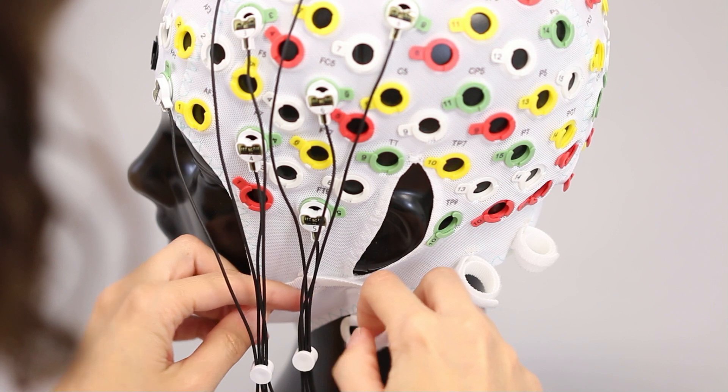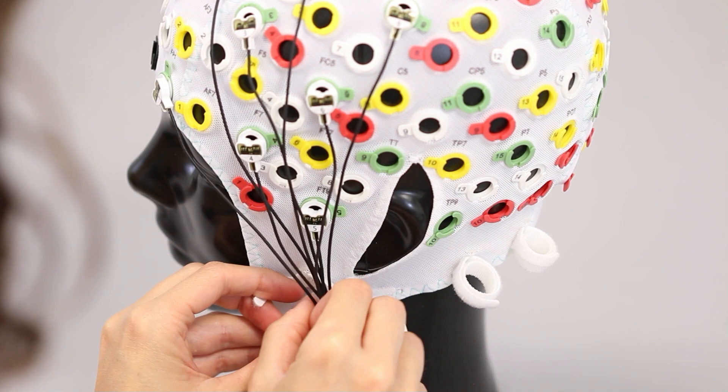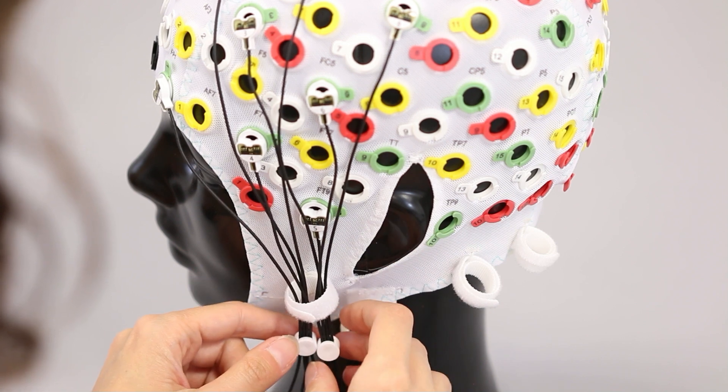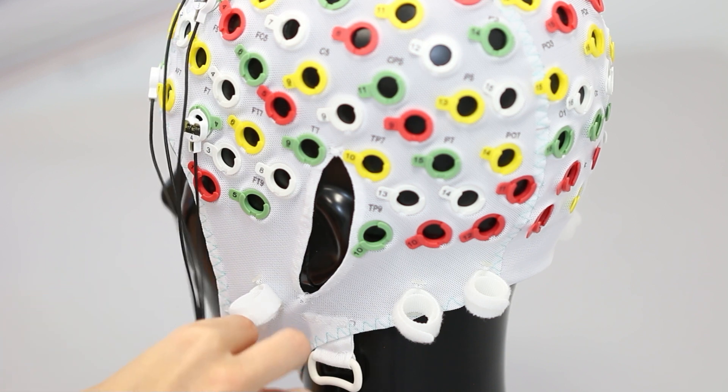route the lead wires into the next closest Velcro strap to stabilize them. This will also work as a strain relief. Adjust the length of the cables again if needed with the cable guides and aim to have them just below the Velcro strap.